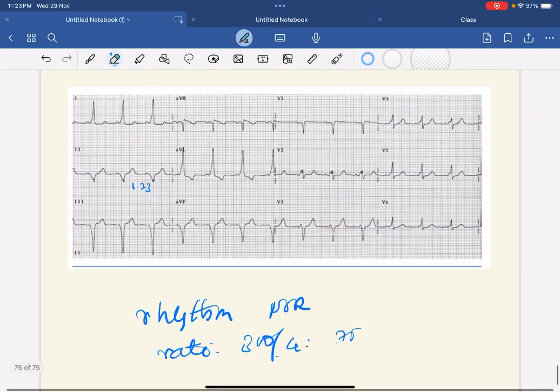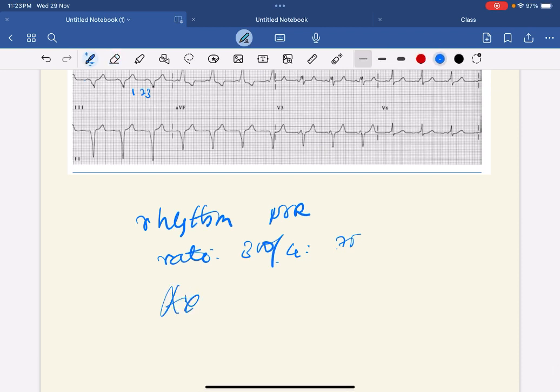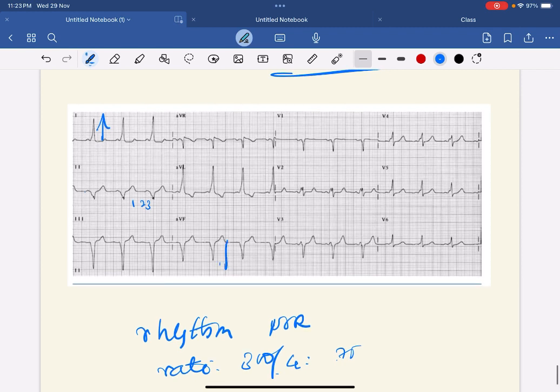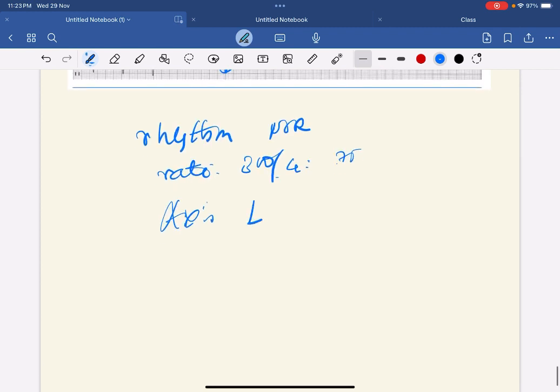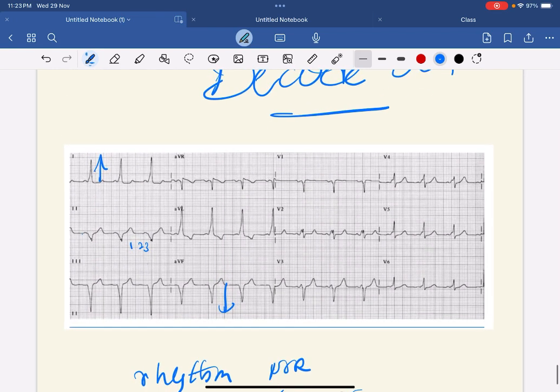After rate, you have to calculate the axis. For that you have to see lead 1 and aVF. In lead 1, QRS is predominantly up, and in lead aVF it is predominantly down. Both are leaving each other — L for L — so there is left axis deviation.